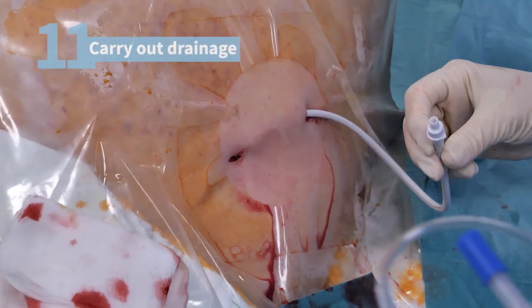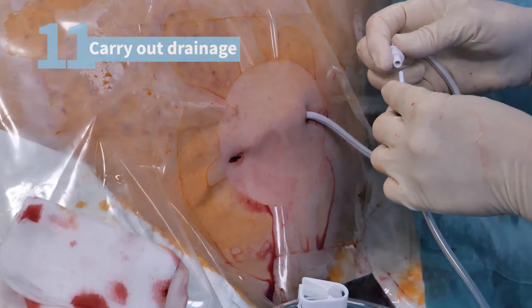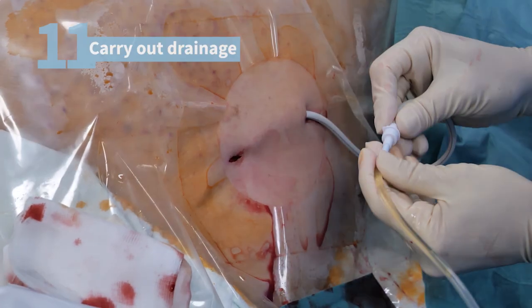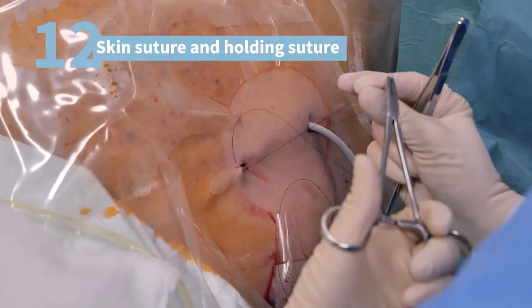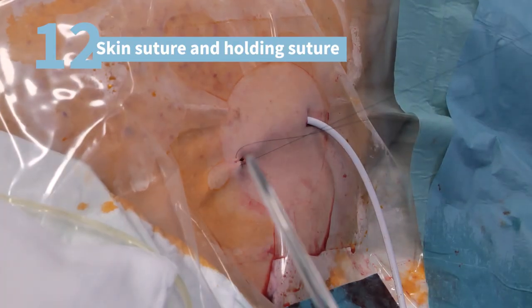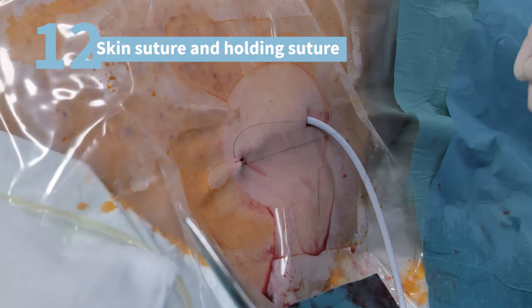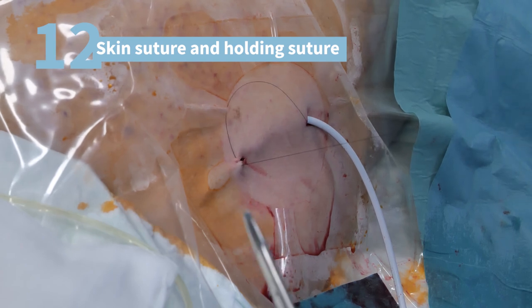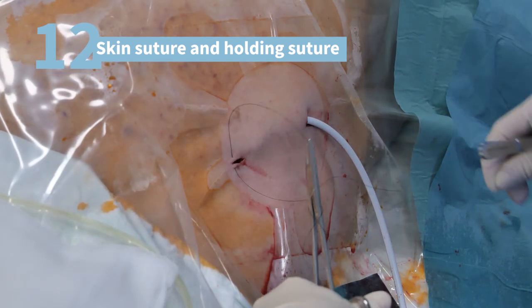The catheter has a safety valve at the end. This can now be unblocked using the access tip, which allows the ascites to be effectively drained as needed. In the next step of the procedure, the catheter is securely fixed in place using 2 carefully placed sutures. These are a holding suture in the area where the catheter exits the body, and a skin suture where the catheter is sutured to the skin.